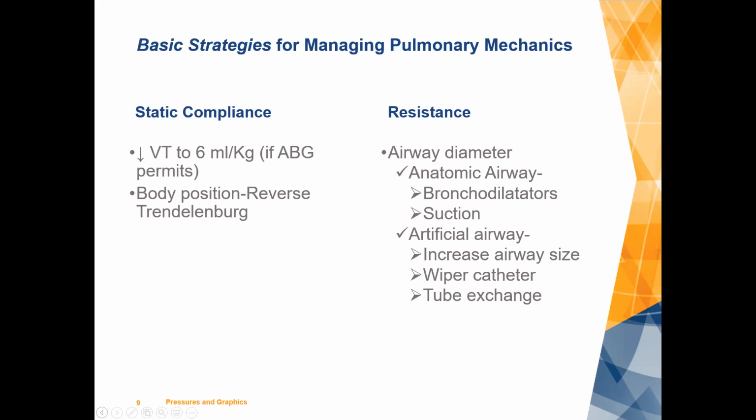Typically, that's not done. Again, just things you can also do with regard to body position, particularly if a patient has ascites, a swollen abdomen, or they're simply pear-shaped and have a lot of adipose, a lot of tissue in the belly. You can offload some of that just by positioning the patient. It's not unusual to be able to gain 2, 3, 4 points off of both your peak airway pressure as well as your plateau pressures.